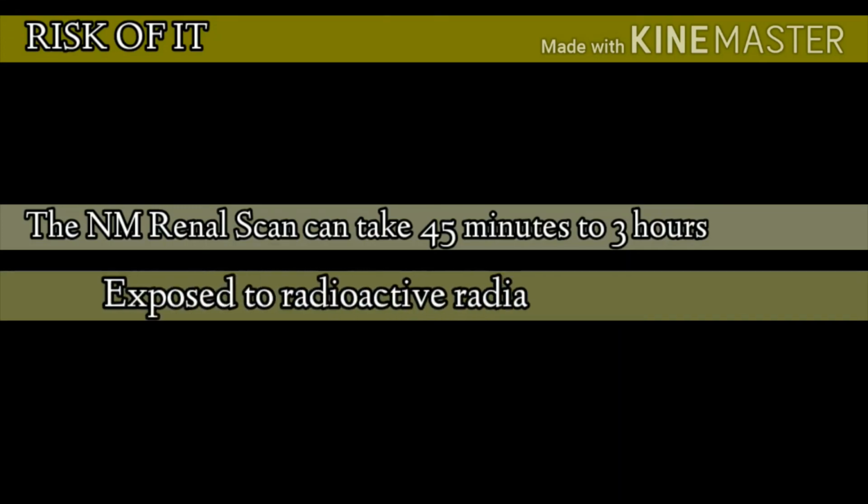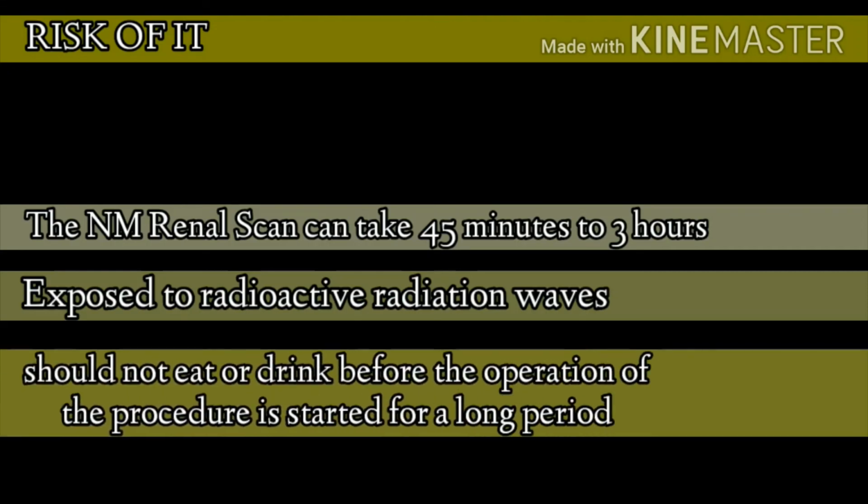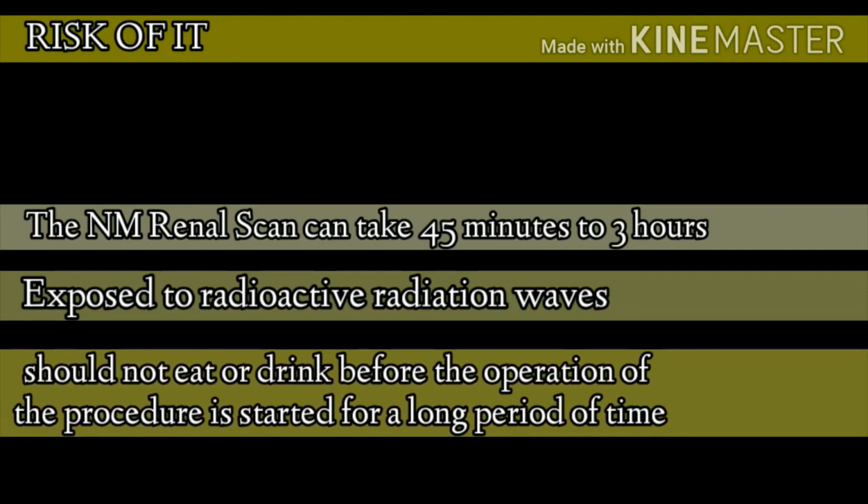Risks of it. First, the NM renal scan can take 45 minutes to 3 hours. Second, you are exposed to radioactive radiation. Lastly, you should not eat or drink for a long time period before the procedure starts.